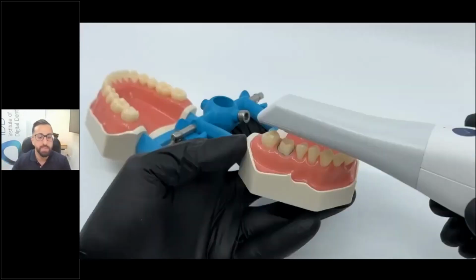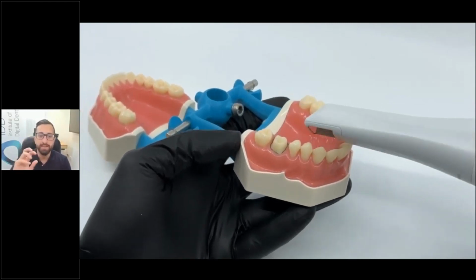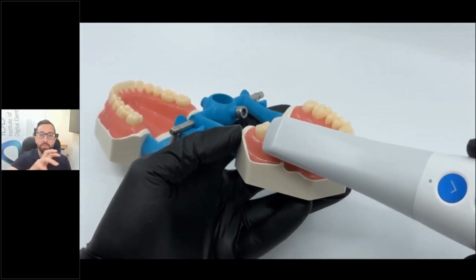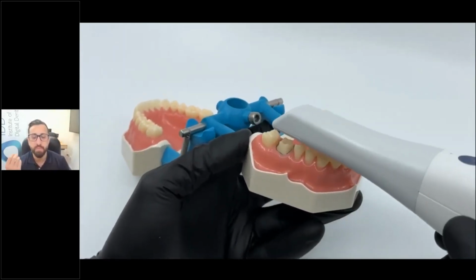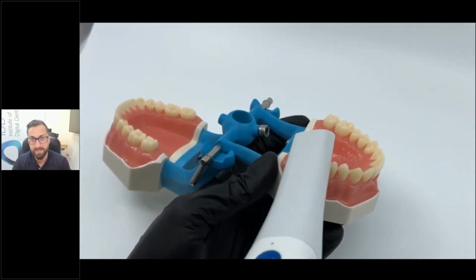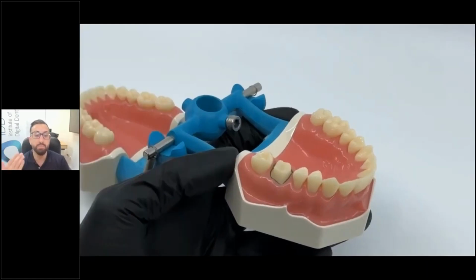The other thing to realize and be comfortable with, guys, is rotation of your hand when holding the scanner. That's a really, really key skill to learn, because I find too many people are not comfortable rotating from the buccal and the palatal in a smooth motion. The last thing that you will notice is how fast this is. This is the reality of intraoral scanning and how many benefits it provides for you, in that you really can move this fast to take a scan. The other thing I notice a lot of dentists doing is that they're moving too slow. Again, practice makes perfect. Practice as much as you can, and that's how you're going to master the skill.